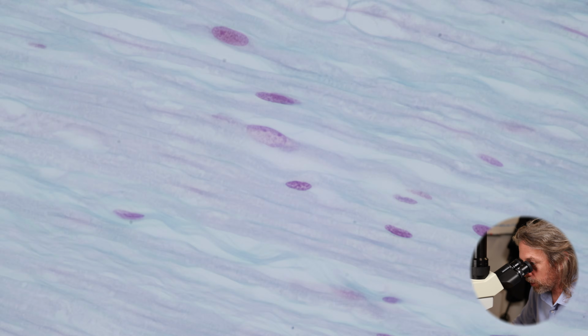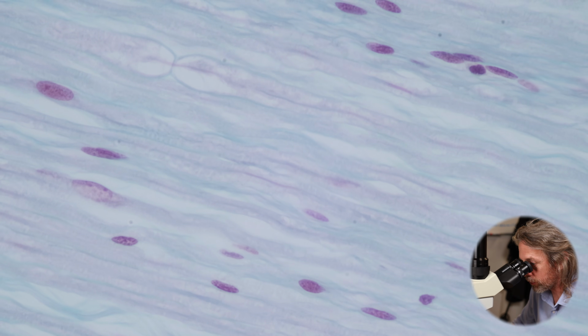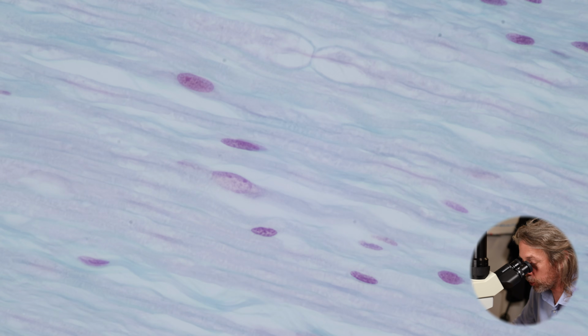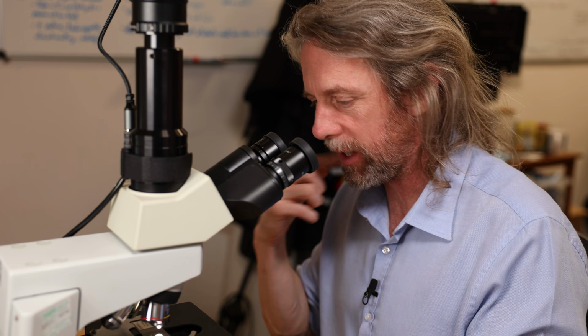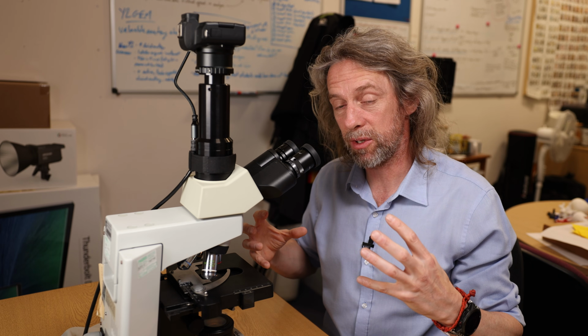Right, so this is us looking at the axons of neurons, and the axons of neurons come from the cell body. The cell body is somewhere else. So where is the cell body? Well, the cell bodies of neurons are much, much larger than their axons.